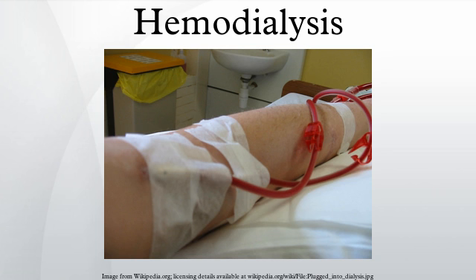The tube is connected to a 15, 16, or 17-gauge needle inserted in the dialysis fistula or graft, or connected to one port of a dialysis catheter.